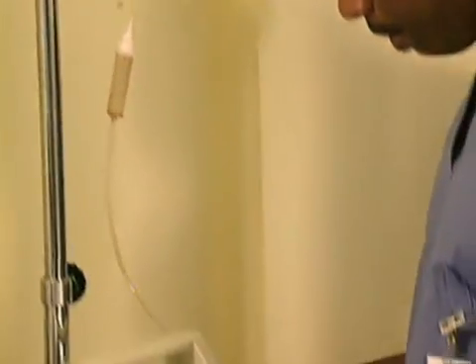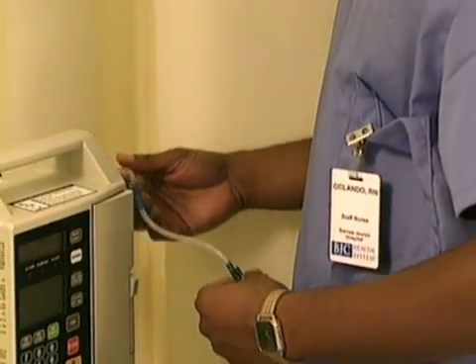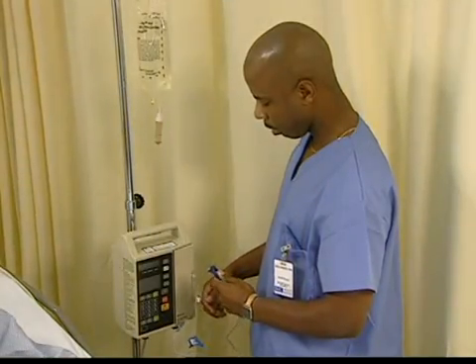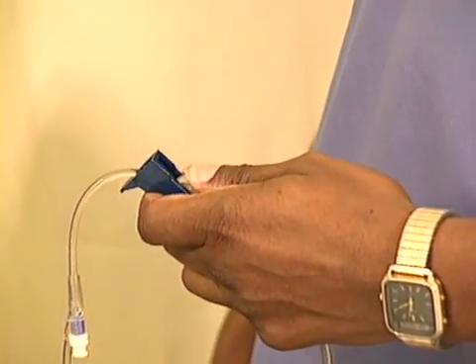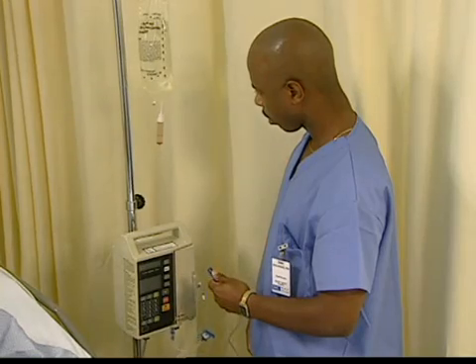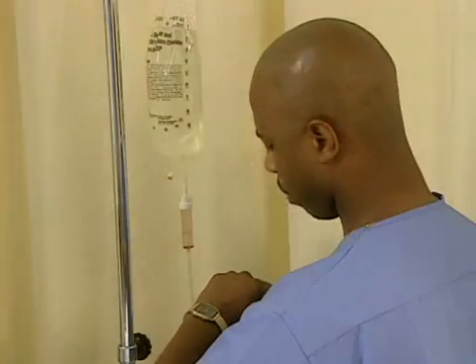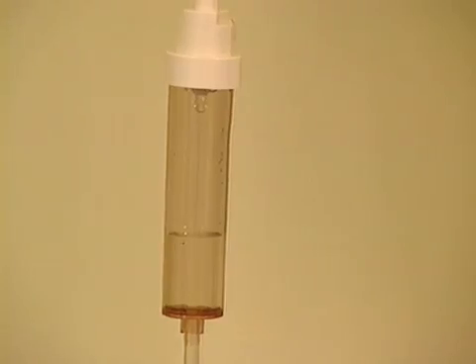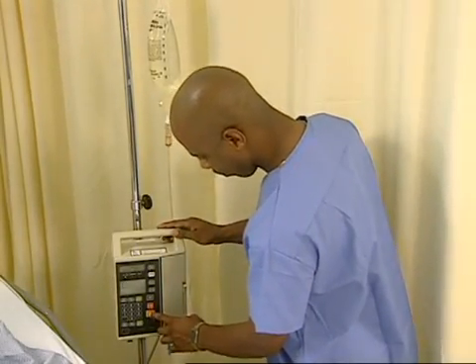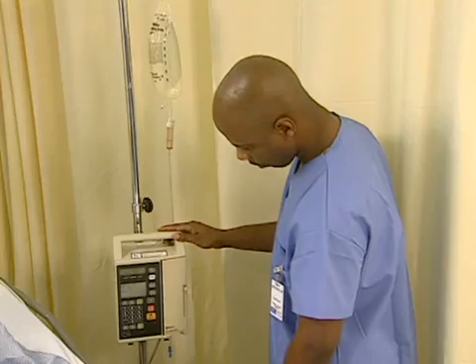The standard approach for controlling the infusion rate is to manually regulate the drip chamber that attaches to all IV tubing. Once you have determined the drops per minute to be infused, adjust the roller clamp on the IV tubing until you can regulate the desired drops per minute. Use your wristwatch and observe and count the drip rate for 1 full minute to ensure the rate is correct. A variety of electronic infusion pumps and other devices are available for more precise control of infusions.